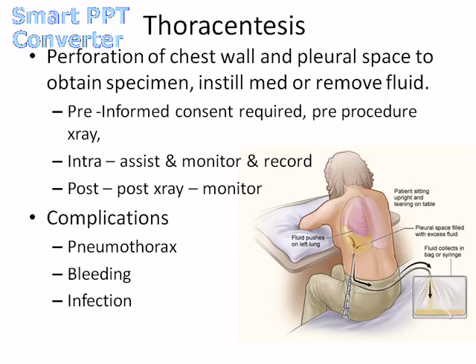It's strict sterile or surgical aseptic technique. We're going to tell the patient they'll feel pressure. We'll watch their vital signs, saturations, and then we're going to measure the amount of fluid that comes out.